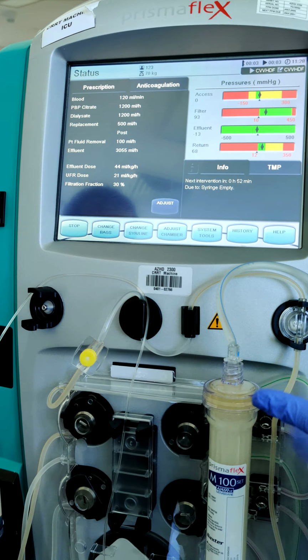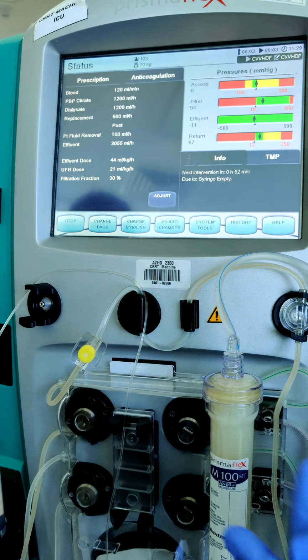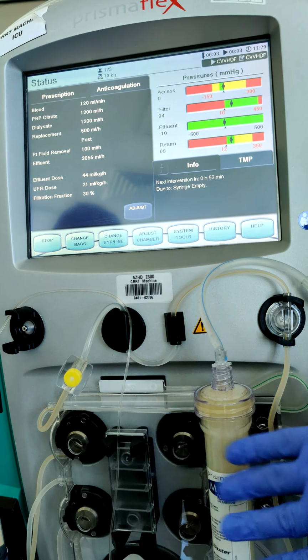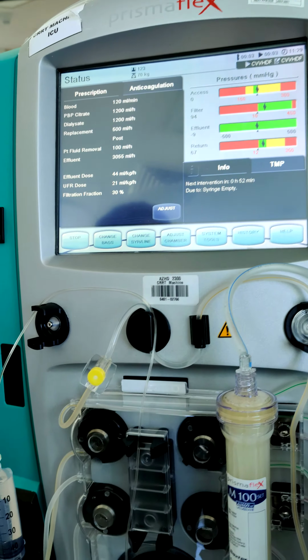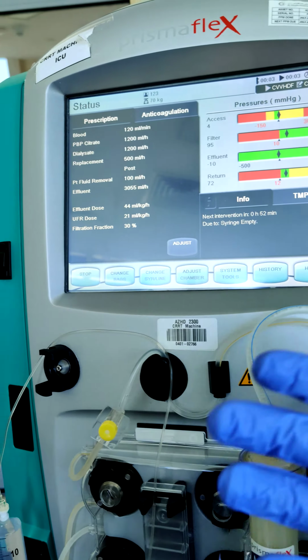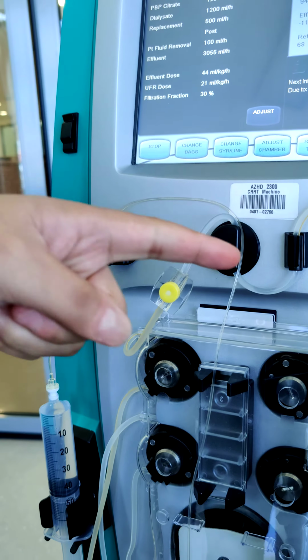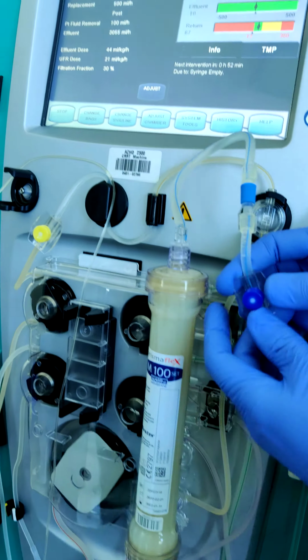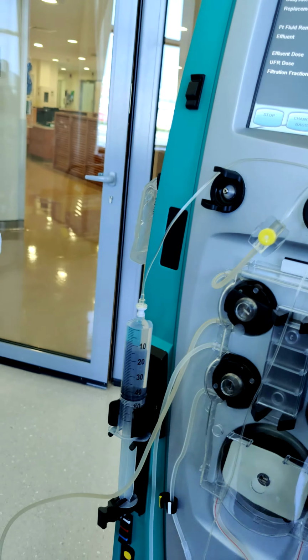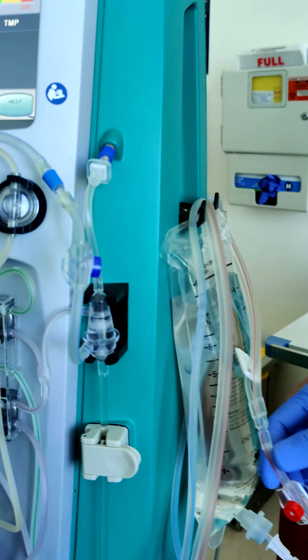Now before we start, we should take two samples. Once we adjust it, now we start the blood circulating. Yes, take first. Now the blood is detected. We should have checked the patient and the blood. Where would you check the blood? Here, post the filter, from the circuit, and from the patient, the red one, the access, the red one, and blue.